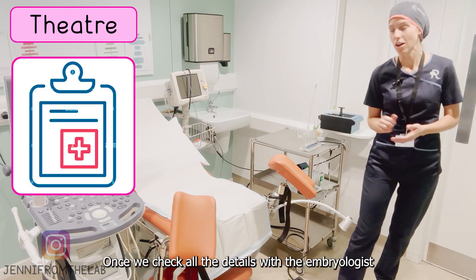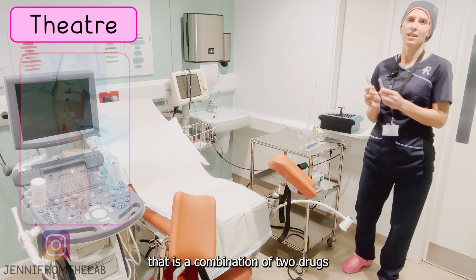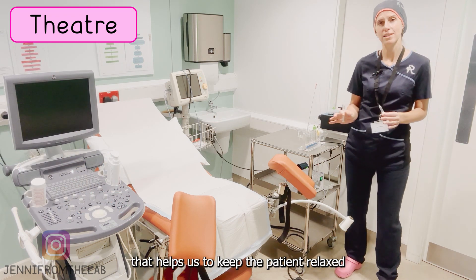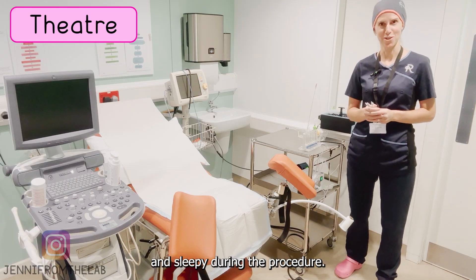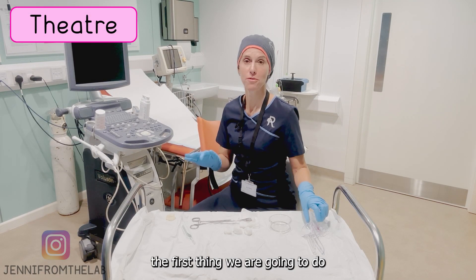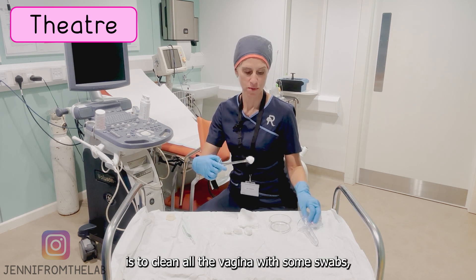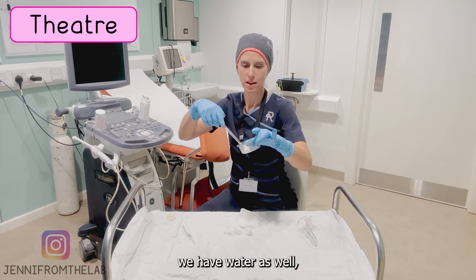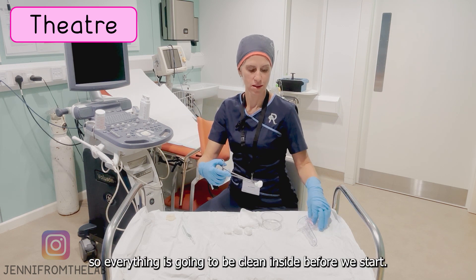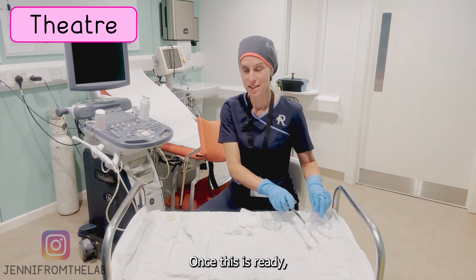Once we check all the details with the embryologist, we're going to start with the sedation. It's a combination of two drugs that help us to keep the patient relaxed and sleeping during the procedure. Once the patient is relaxed on the bed, the first thing we're going to do is clean the vagina with some swabs — we use water as well — so everything inside is clean before we start.